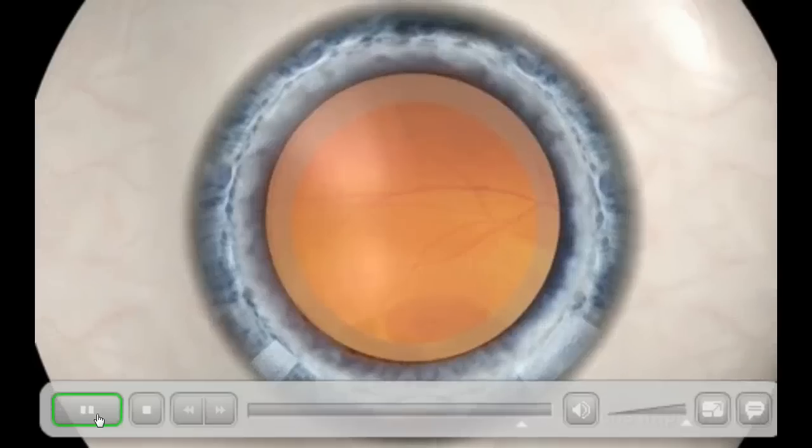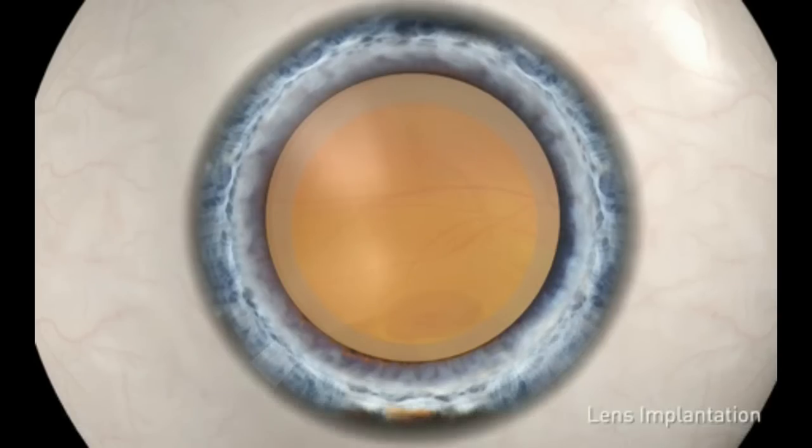Once the cataract is removed, the intraocular lens of your choice is inserted through the self-sealing incision and locked into position. Typically, no sutures are required. The entire procedure takes only 15 to 20 minutes.